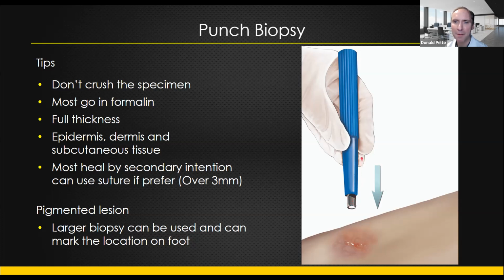Otherwise, you look kind of funny because sometimes you take the end and try to blow in it, or drop water or saline in it, but you're putting it in formaldehyde. So tips: don't crush the specimen as you do it. When you take it out, try to get it out without injuring it.